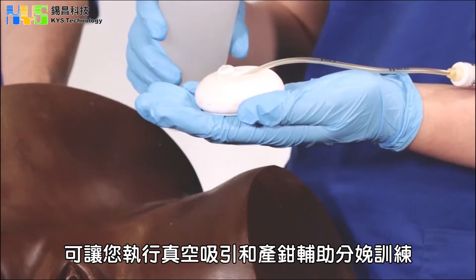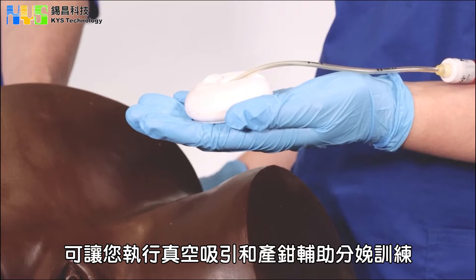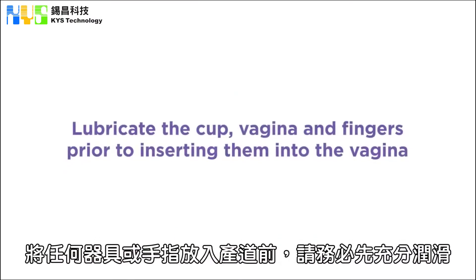This trainer will allow you to simulate the use of a vacuum extractor or forceps. Please lubricate the cup and the vagina prior to inserting the cup or even when just inserting the fingers.